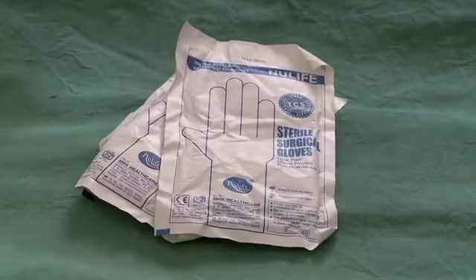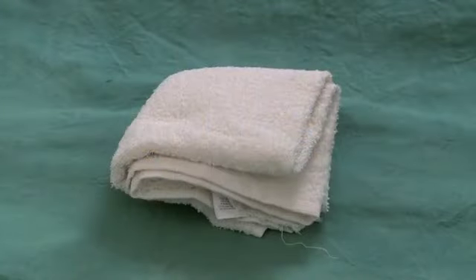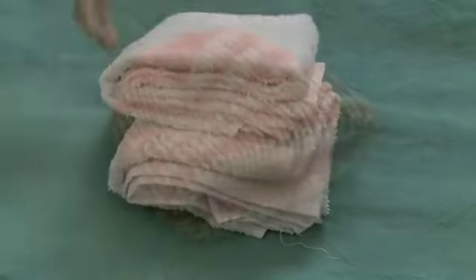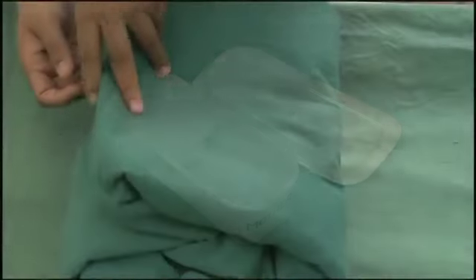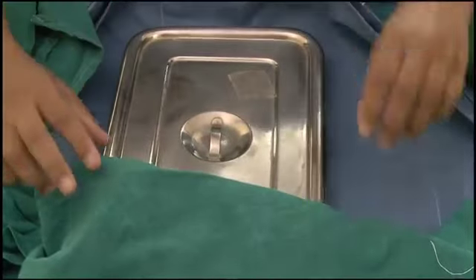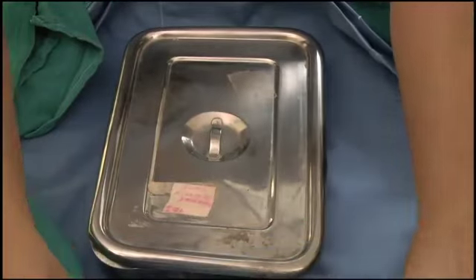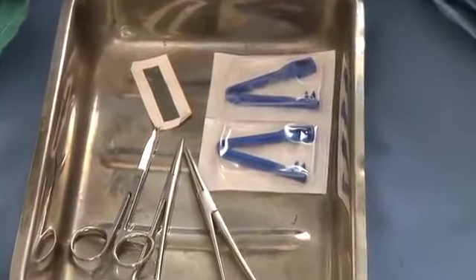For the birth, have two pairs of sterile surgical gloves, two towels to dry the baby, a hat and gauze squares. Have a delivery kit. The kit must be sterile and contain cloths, cord clamps or ties, two artery forceps and a new razor blade or scissors for cutting the cord.